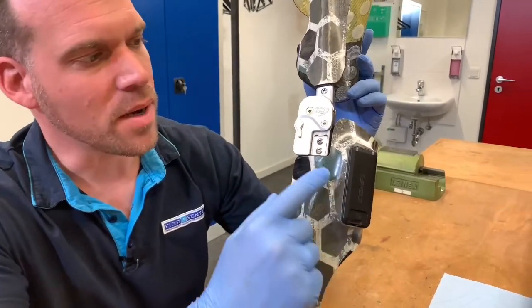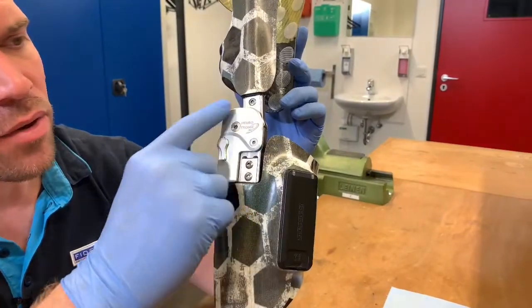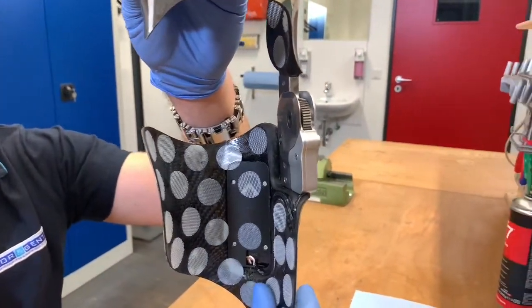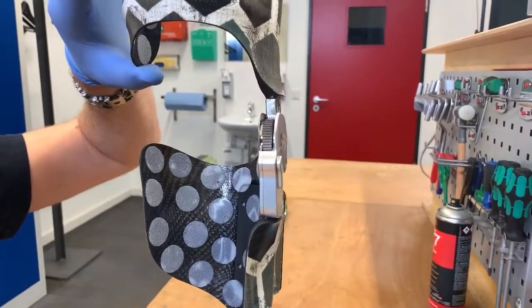In this step, we check the joints for visible damage. Today we want to concentrate on the neurotronic knee joint. As you can see, the joint is in perfect condition, but we can also feel some play in the medial-lateral direction.